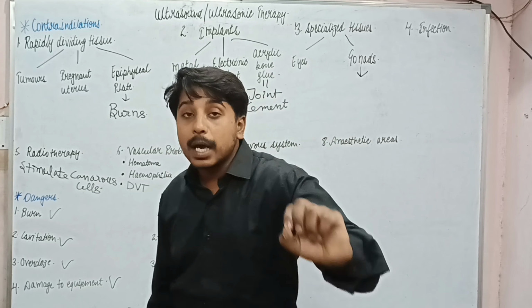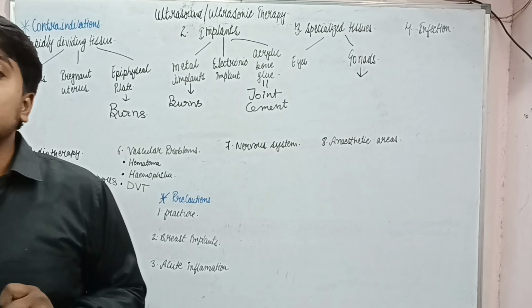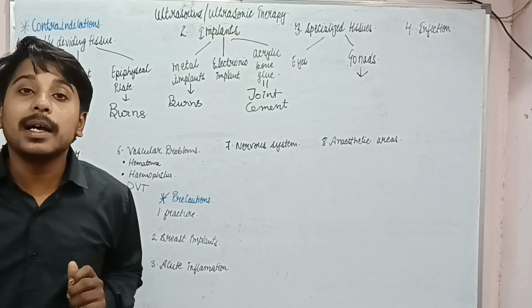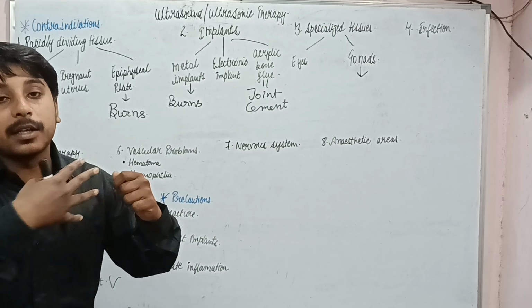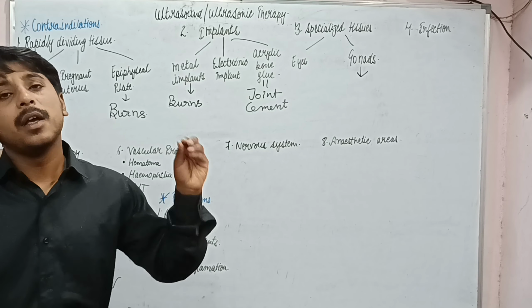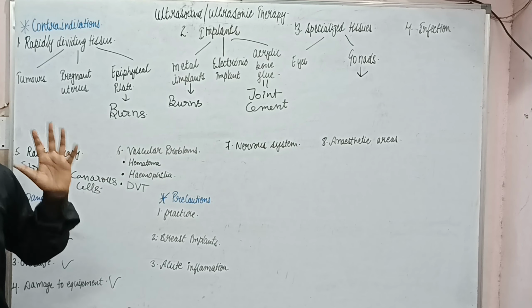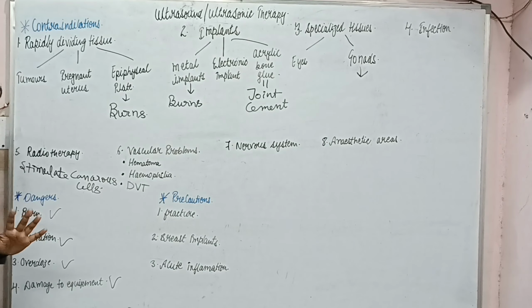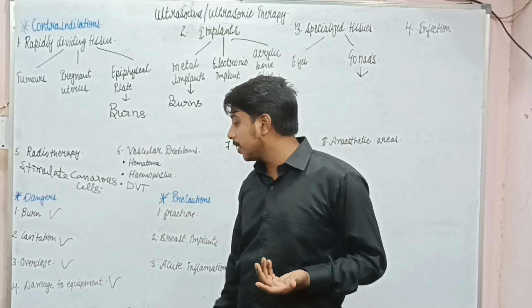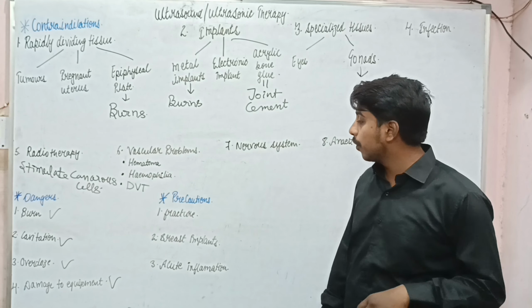Yes, if we are not placing the ultrasound head in contact with the skin, that is it is in the air, so the reflection of the ultrasound wave can lead to formation of standing wave, which can damage the piezoelectric crystals. Okay, so these are some dangers, which are very simple. Okay, burn, cavitation, overdose and damage to equipment.